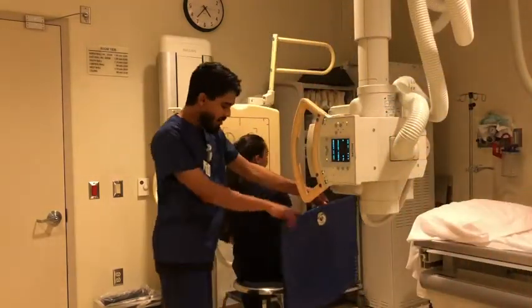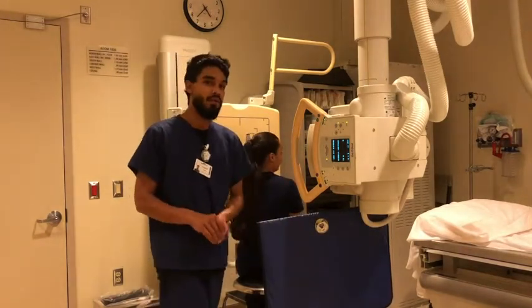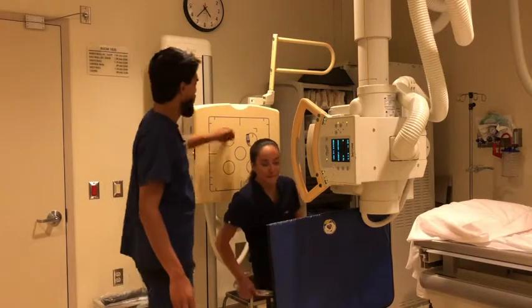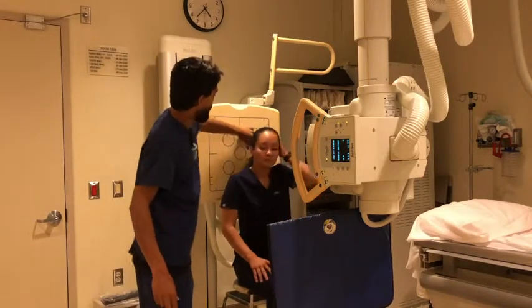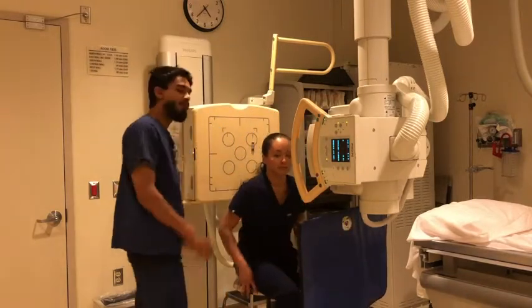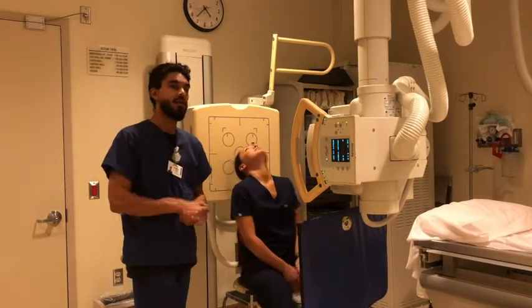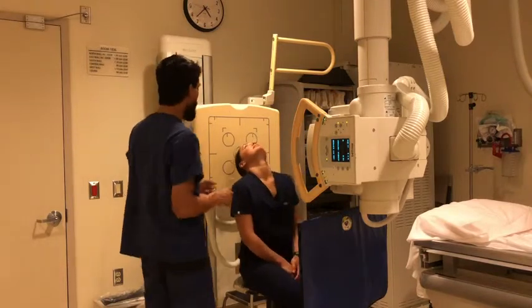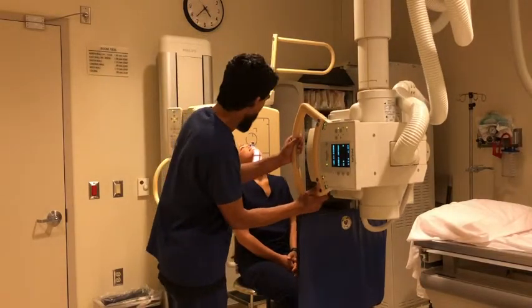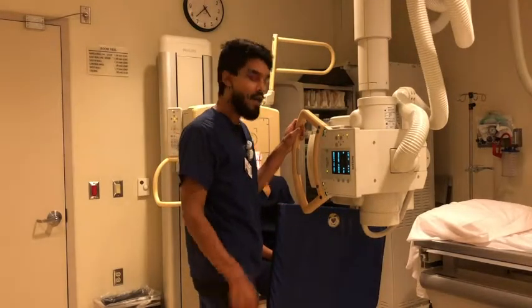Alright, we have one more image to take. So for this one, we're going to be doing a submentovertical projection. So I want my patient to face the X-ray tube. Make sure our marker's in the right place. We want our patient to scoot a little bit away from the board so that she can tilt her head back, and so that the IOML is parallel with the IR. So yeah, that looks good. We want the central ray to enter between the mandibular rami.